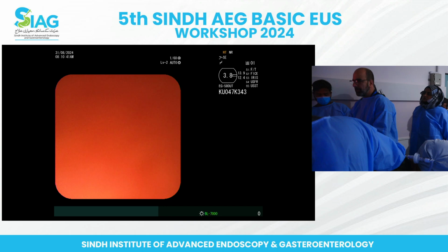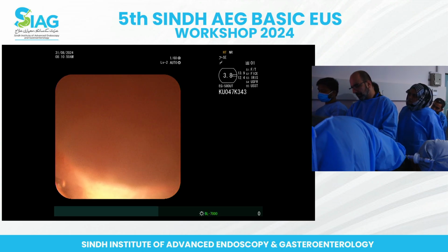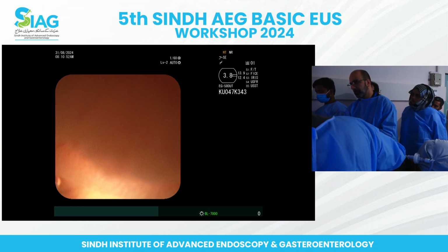Because right here the PD looks normal, the bile duct just has that stent and sludge. To the left of it, I don't see much here. This looks pretty bright, not obviously hypoechoic.